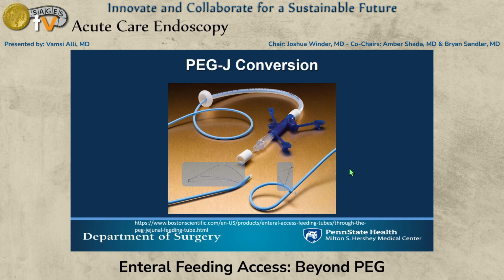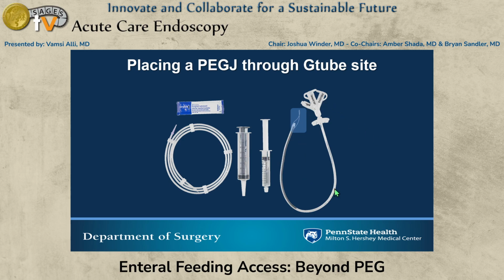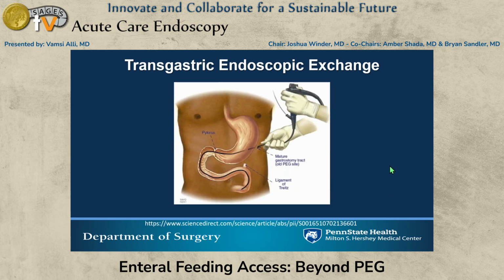Suture loops that you can grab and drag with your through-the-scope clip. This is through-the-scope clips as we've covered already. This is a single-piece system, also with a suture loop so that you can advance it distally.